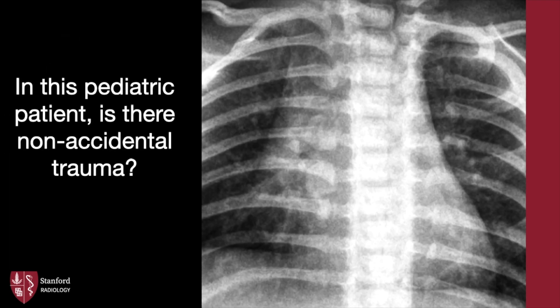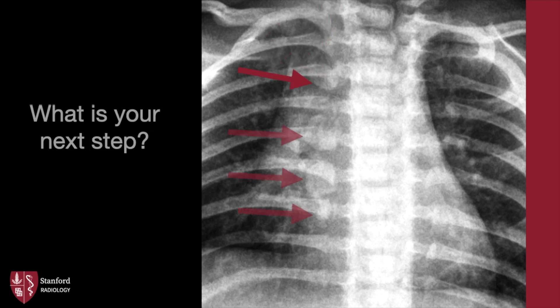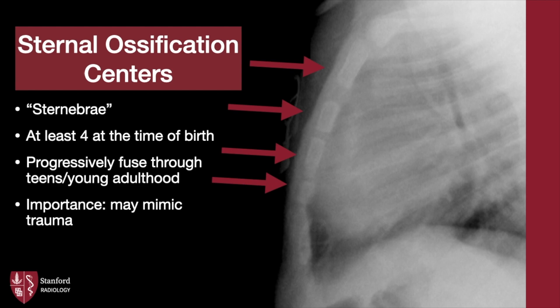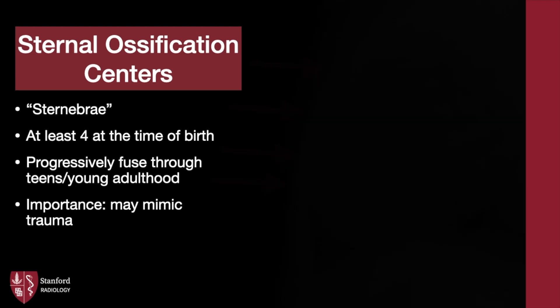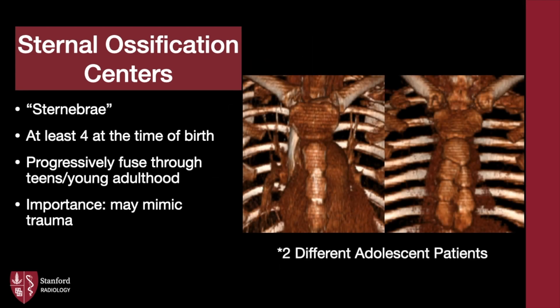In this pediatric patient, is there non-accidental trauma? There are multiple rounded densities projecting over the right costo-vertebral joints; the left side is spared. Fortunately, a lateral view saves the day — these are simply sternal ossification centers, also known as sternibrae. At least four may be present at birth with progressive fusion through the teens and young adulthood. Here are 3D renderings of unfused ossification centers in two different adolescent patients.